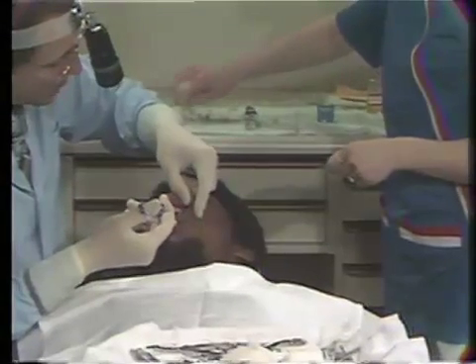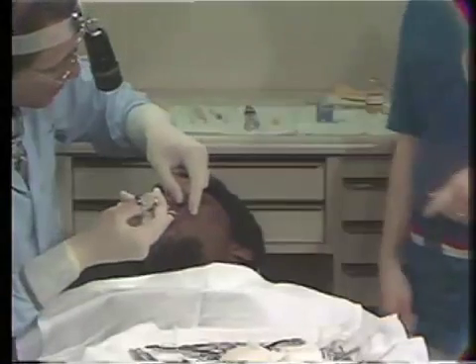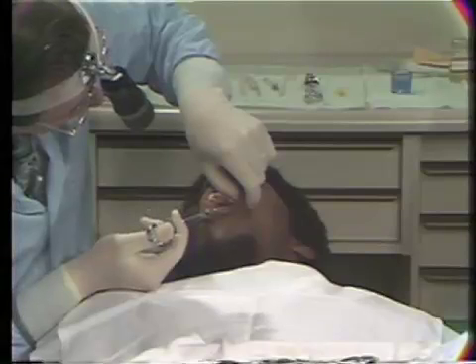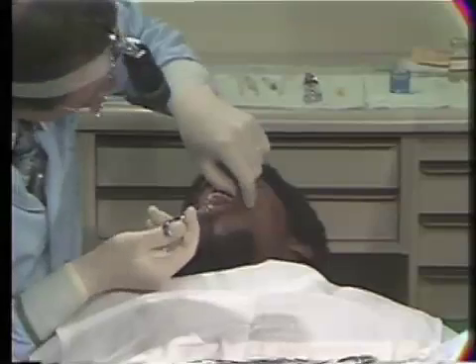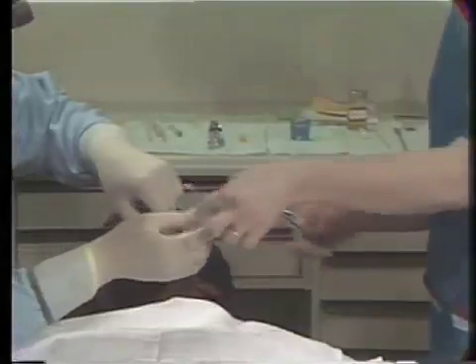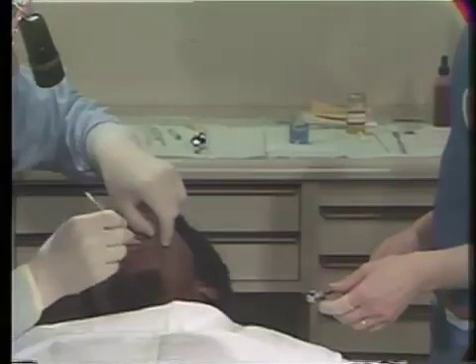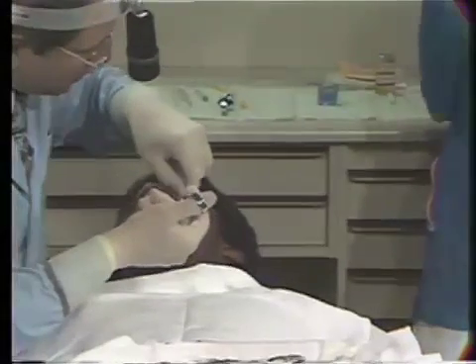But you could notice how she handed the cotton-tip applicators that were already soaked in a topical anesthetic. One was a dry end, and the other had the medication on it. And when she handed the syringe, it was in a working position so that my thumb could go into the holder and I could take hold of the syringe and immediately go into the mouth as she removed the cover from the needle. I'm going to do a papillae injection in addition to the infiltration injection, so this is why she's all ready to go with the second syringe.